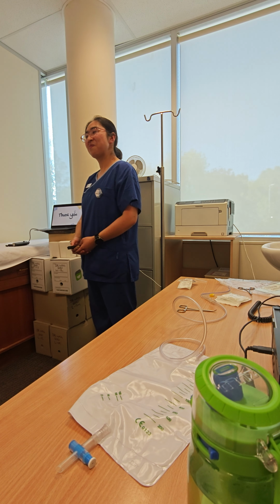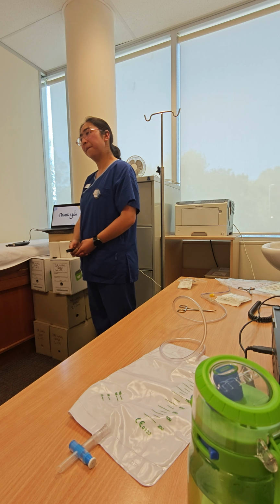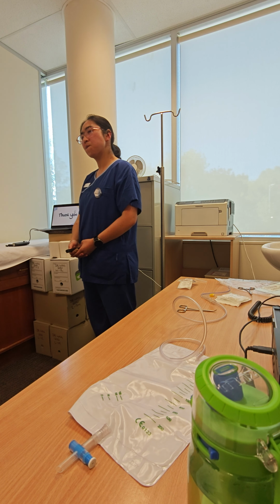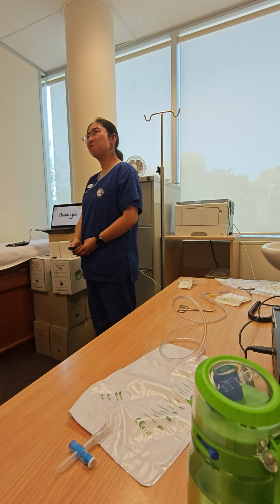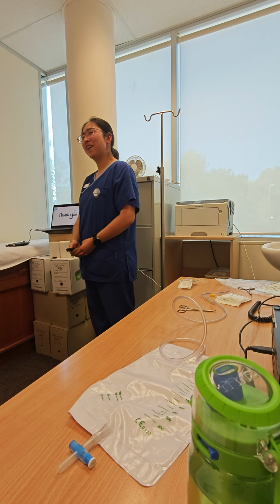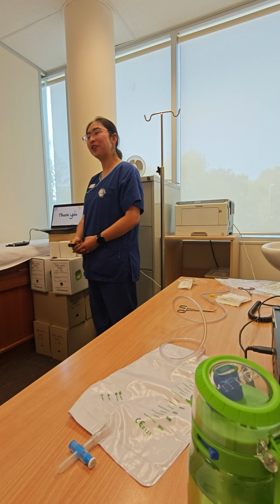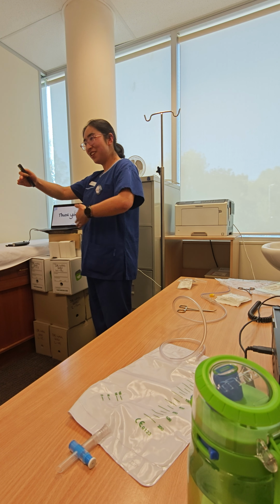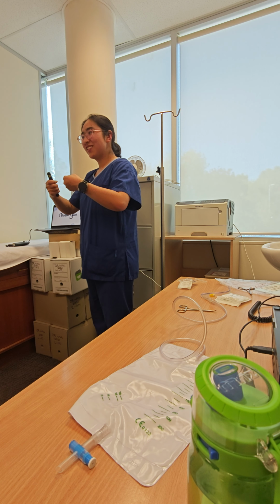So in the case of a female, what is another surgically induced reason why there could be a leak in the bladder? Could you think of a surgery that a woman could have that would make her need a study like this? Ureter? Maybe something wrong there. They have surgery around the area because they need the bladder as well. If they have cesareans and things like that, when they're pregnant, sometimes they can nick the bladder because everything is squished in.